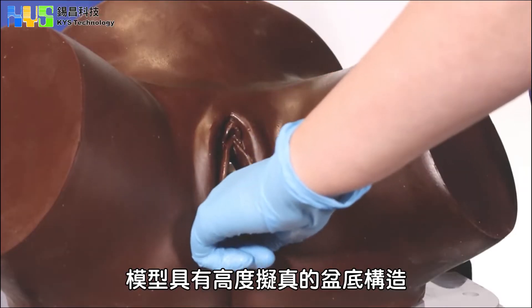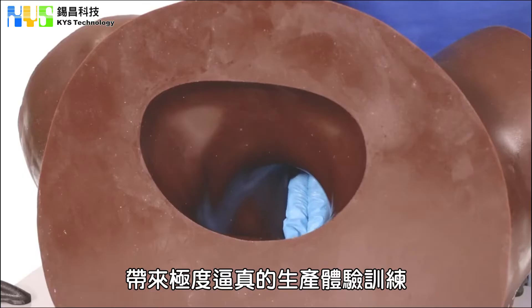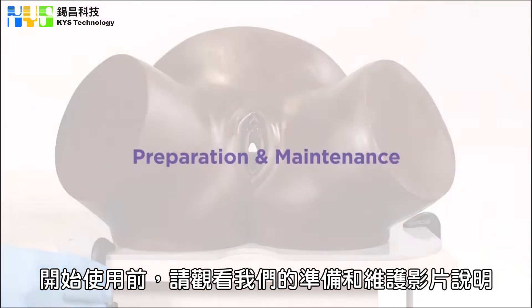The pelvic floor in this simulator accurately represents the pelvic floor in a woman, ensuring the behaviour of the simulator is lifelike when doing deliveries. Please ensure you have watched our video on preparation and maintenance before beginning a simulation.